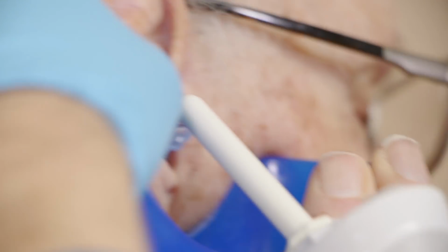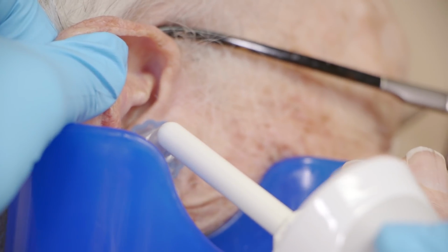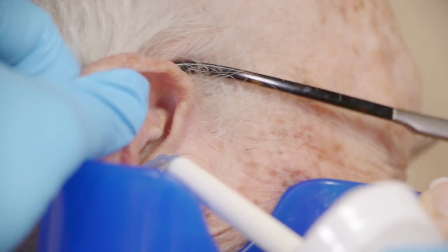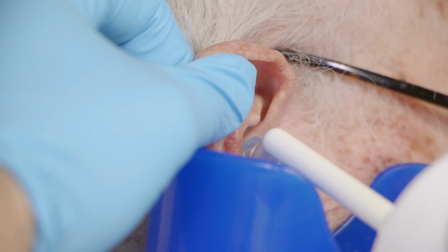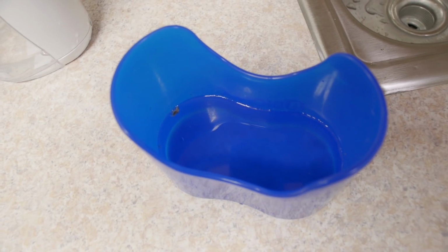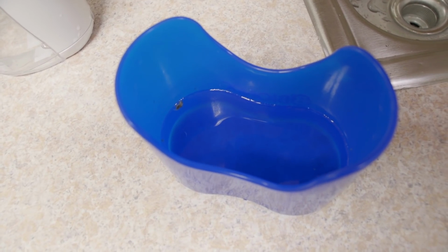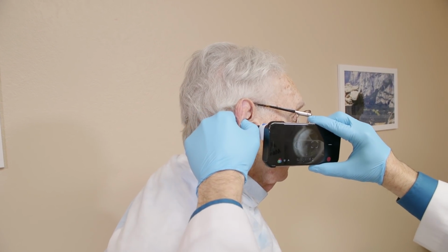Okay. And are you where you want to be? No. Okay. Now there's some coming out. Yeah, I can feel it. And there is some wax inside of the tank here. Looking in after the second irrigation to find a much cleaner canal. But there's still, boy, there is wax all down there.